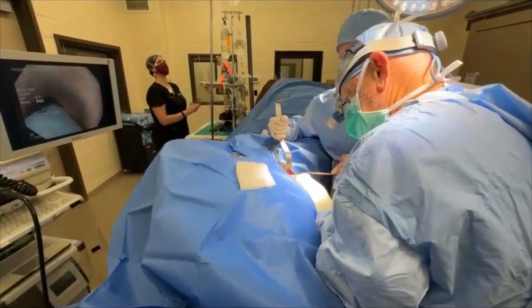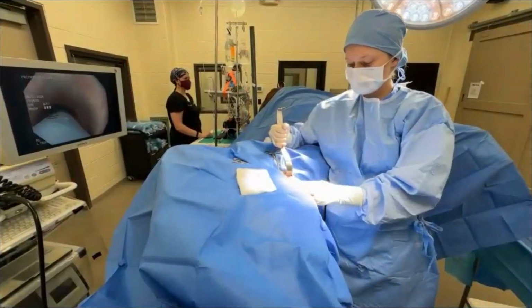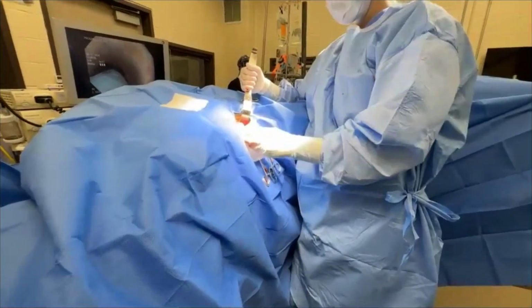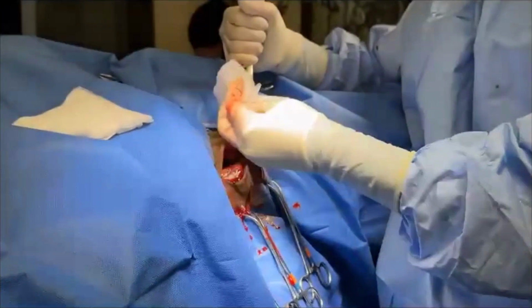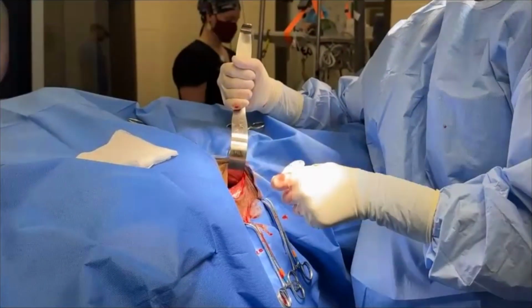Okay. Right. But essentially what's happening is we're putting the suture along the same plane as the muscle that would, if it was working, be contracting. That muscle that is becoming paralyzed is called the cricoarytenoideus dorsalis muscle. It runs from the cricoid cartilage to the muscular process of the arytenoid, and we put the sutures along the same path as that muscle. And then when we tighten the sutures, it acts like that muscle in contraction.